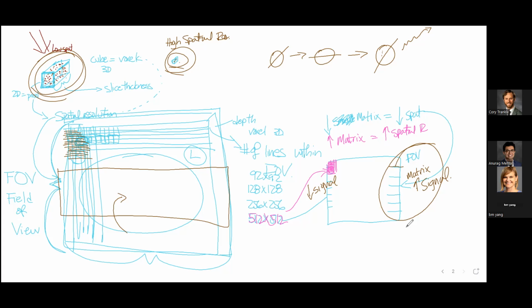Okay. So in summary, we've talked about the basic fundamentals of the imaging process. We're not looking at reflection of ultrasound. We're not looking at diffraction of X-rays in the cath lab or the CT scanner. What we're doing is imaging protons.